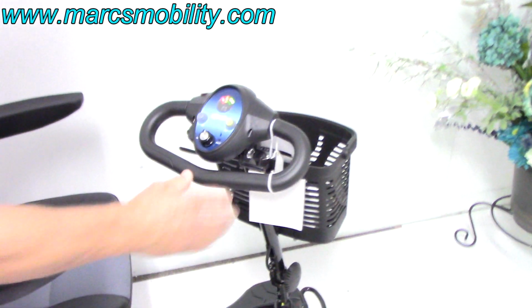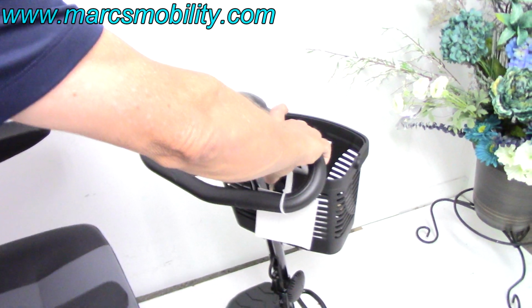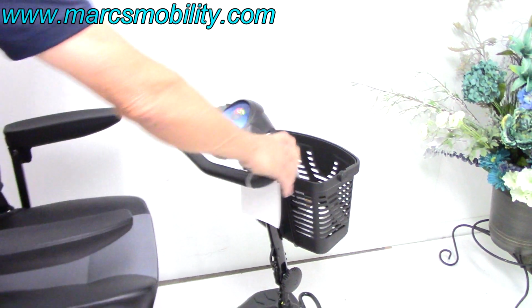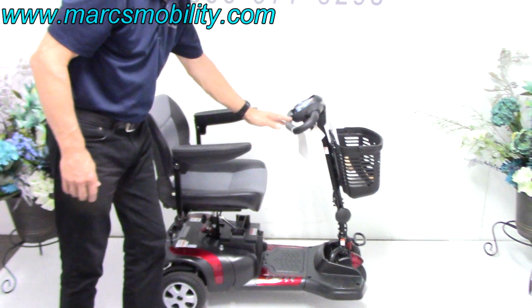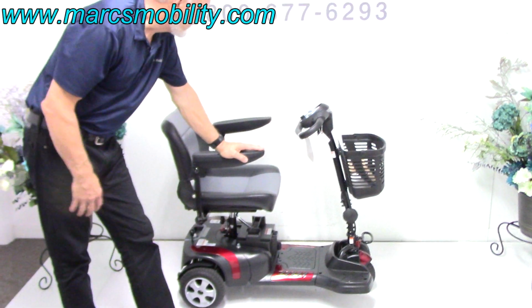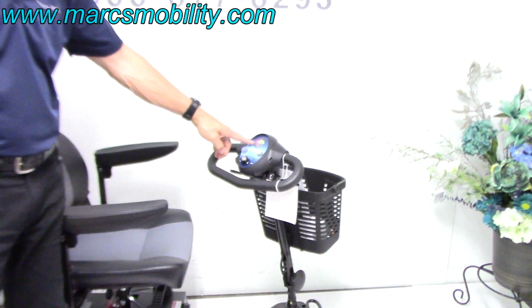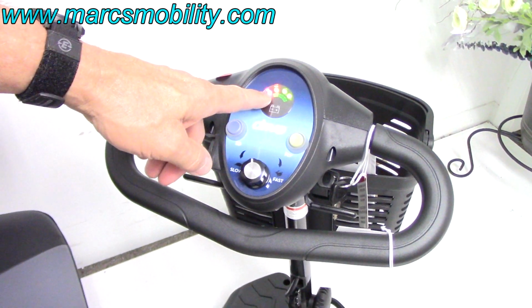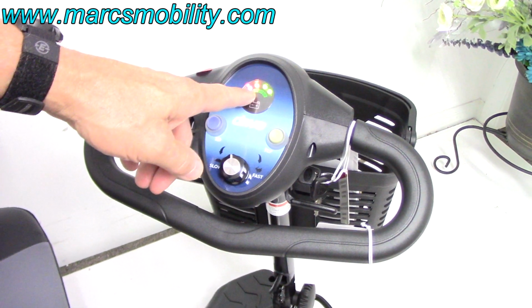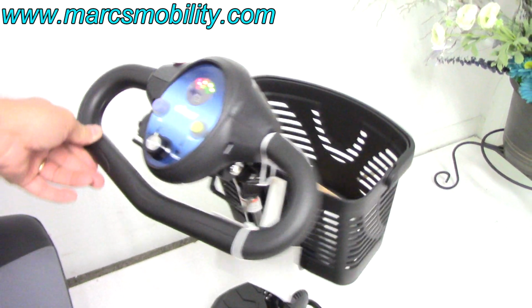So if you only have one hand, you could drive it forward here, and you could go reverse on the same side just by pushing the lever the opposite direction. You can also do the same thing on the opposite side, okay? And you have a battery gauge right here that tells you how your batteries are doing. You can see right now the batteries are full. You got green, green, orange, and red. You lose one light at a time as you're using your batteries. It tells you on the battery gauge right there.